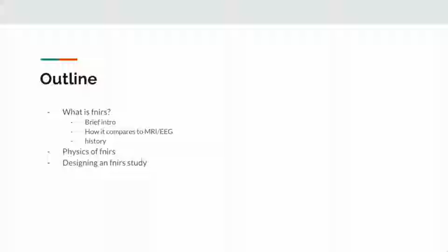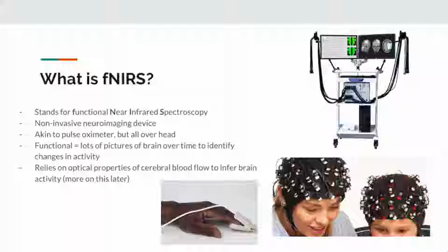Okay, so for today, I'm going to cover what is fNIRS, a brief intro and how it compares to other modalities that those of us in the room may be familiar with, why you might want to choose fNIRS over others, some history about the imaging technology so you know where it comes from, the physics lesson, and the first part of a high-level overview of what you need to be thinking about when you're designing an fNIRS study.